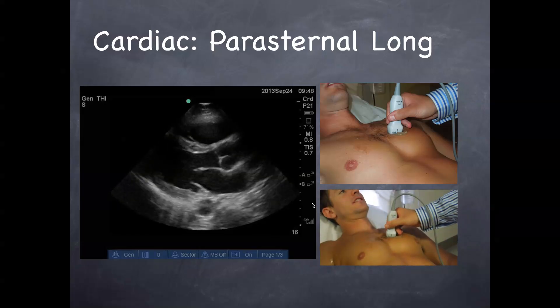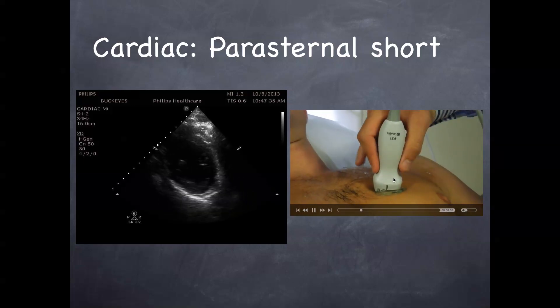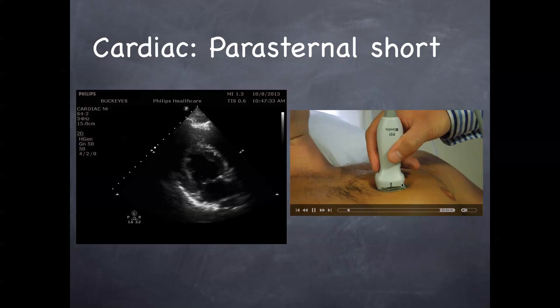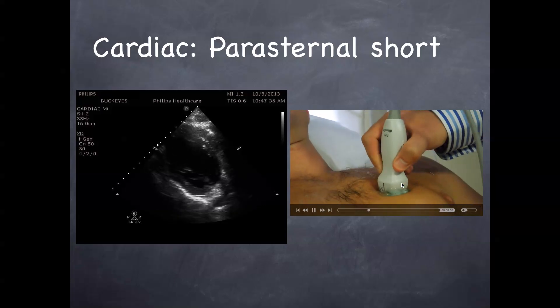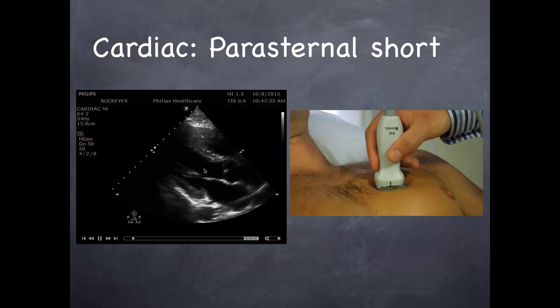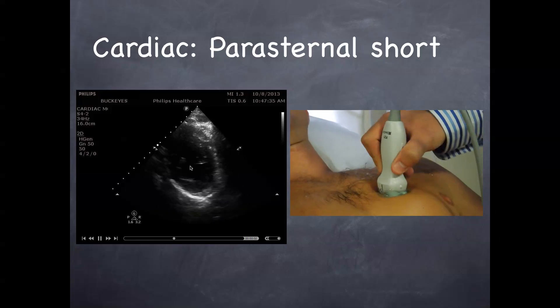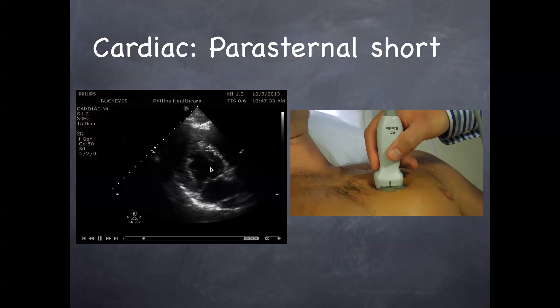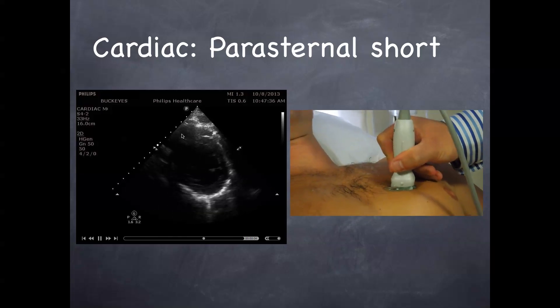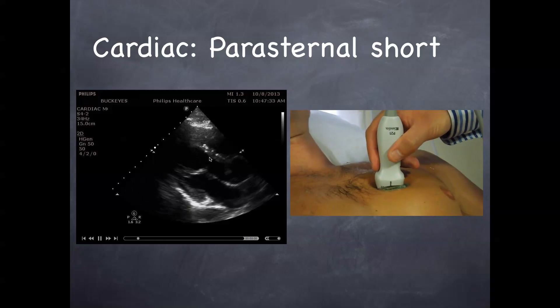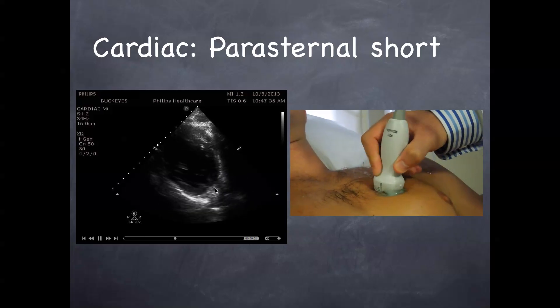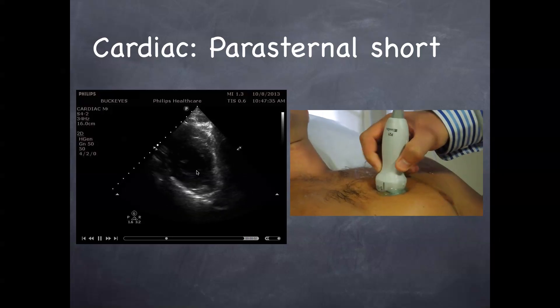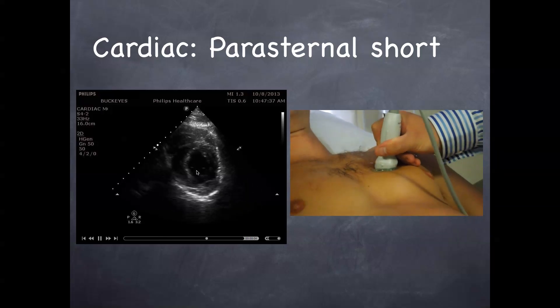To gain the short axis view, you're simply going to take your probe and rotate it right where you were — rotate it to the right hip. So you're moving from the left hip orientation, just twist it, take it to the right hip. Long axis, twist, and here's your short axis. Right ventricle is closest to the probe, here's your LV, and this is the view where you're going to be assessing contractility and looking for any significant or overt wall motion abnormality.